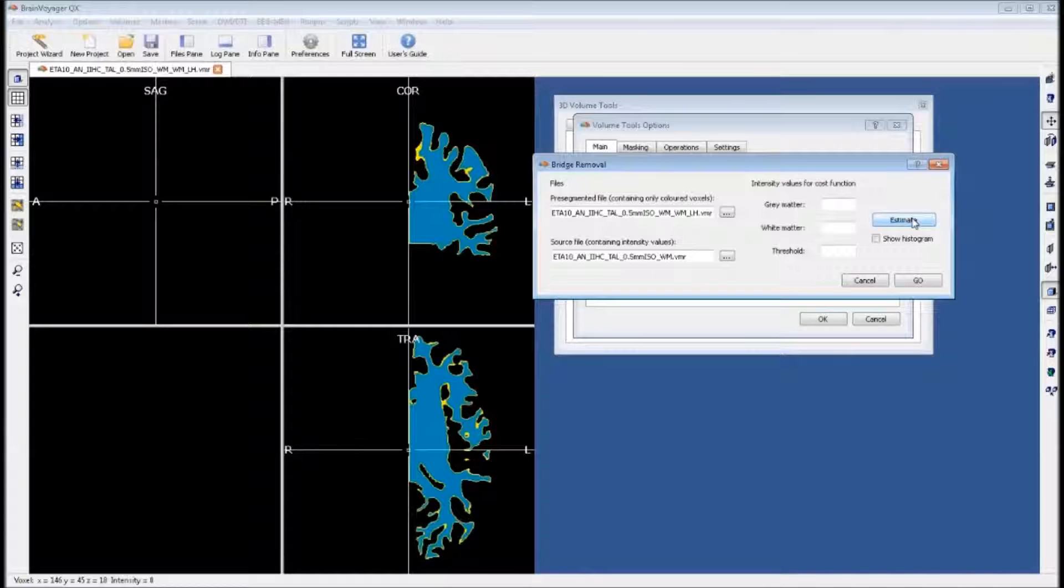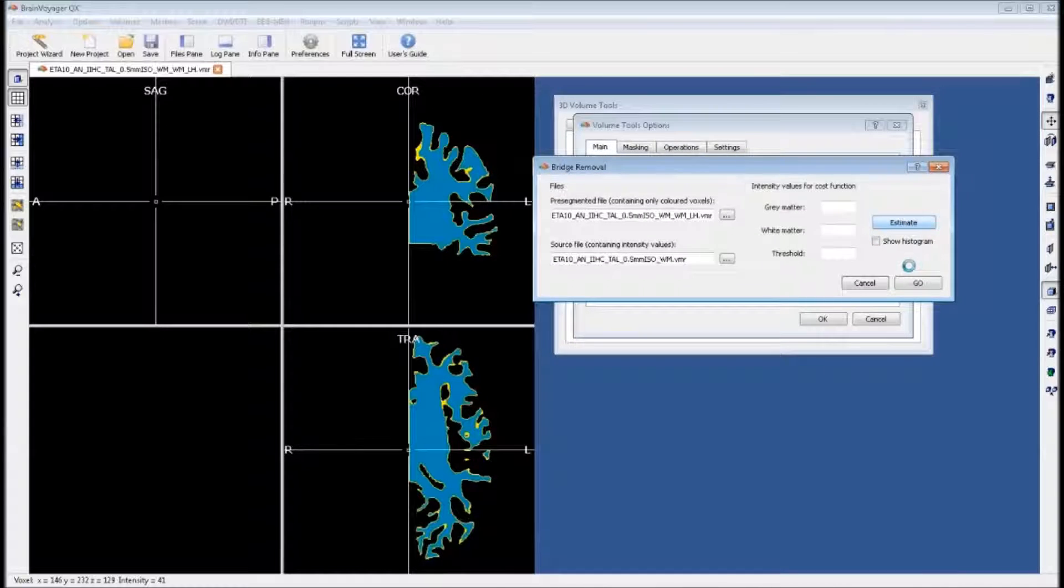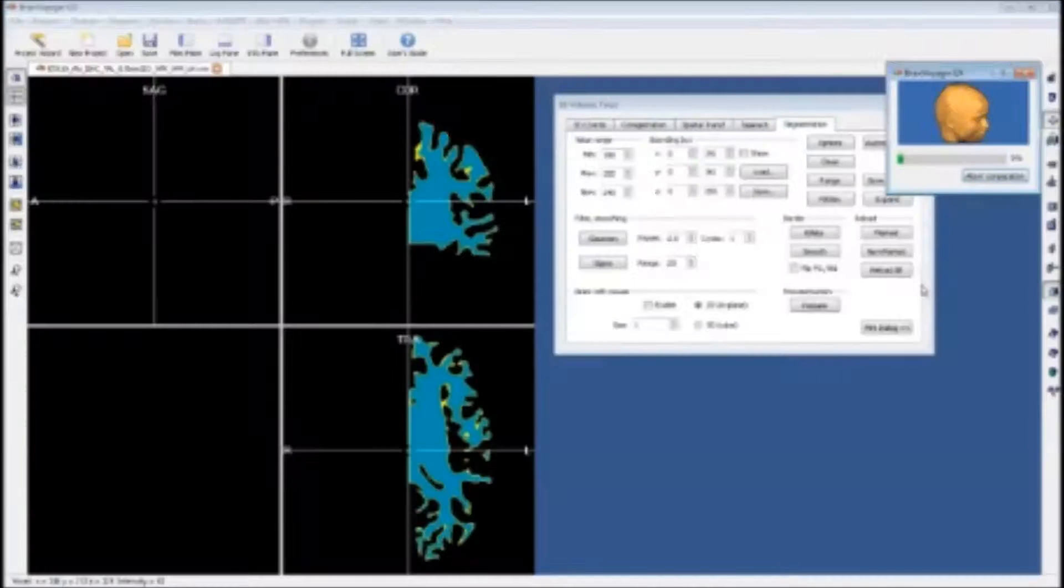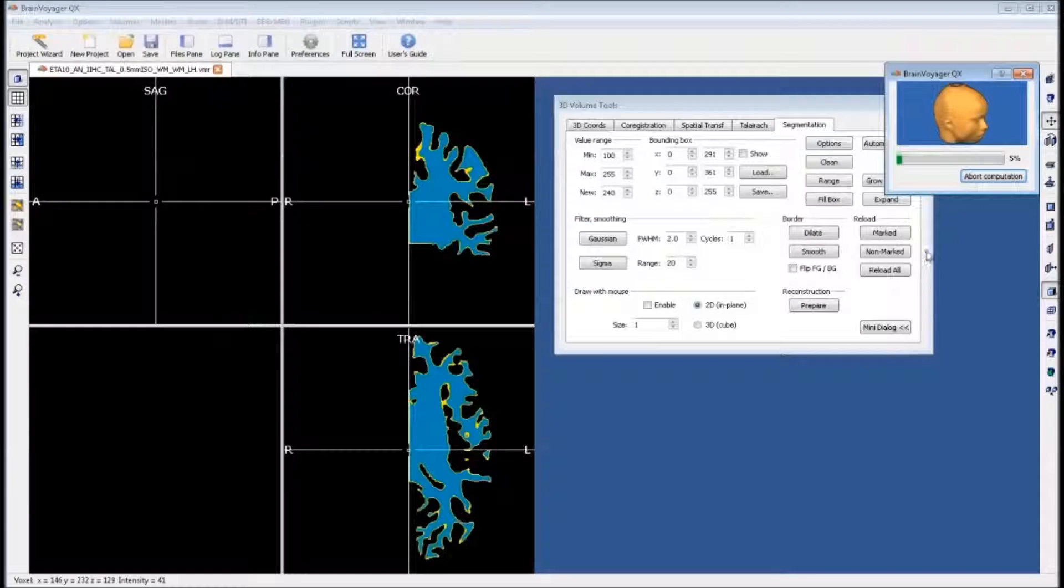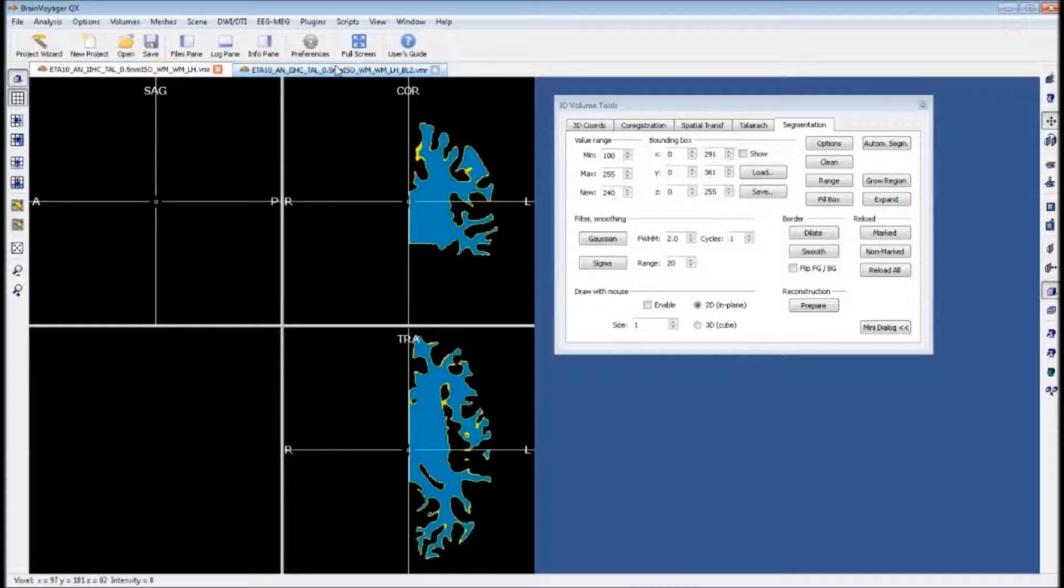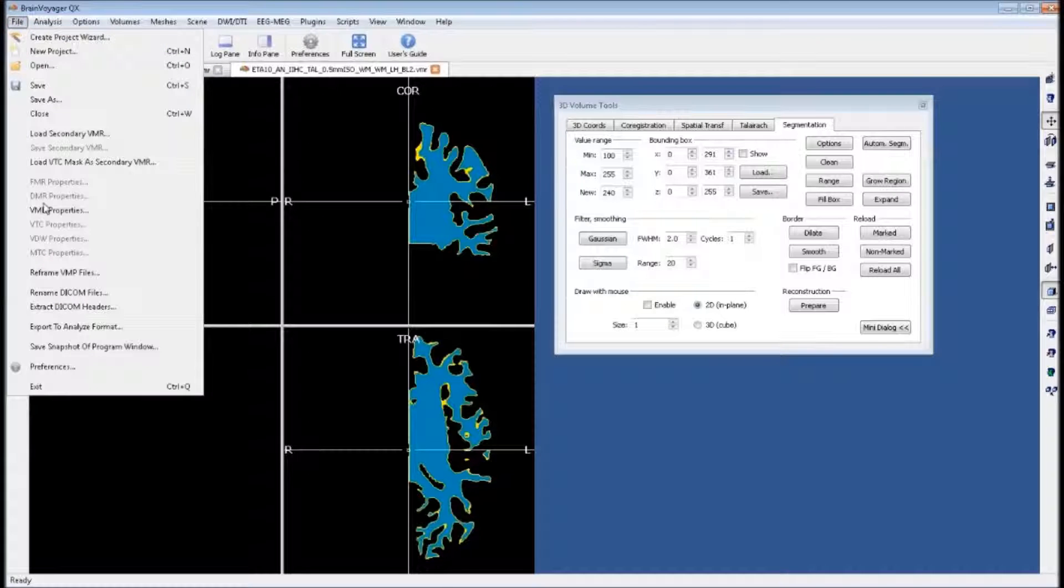Next, you want to estimate values for gray matter, white matter, and our threshold. Once we have these values, we can click go. This process will take some time. Once it's complete, what you will find is you have the original and a new version with the bridges removed.